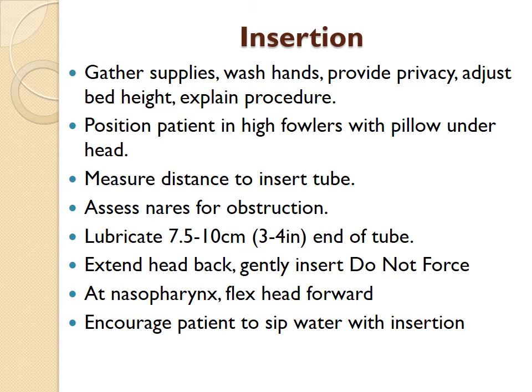Don't forget, if you have the patient down in the lowest position, you're going to be bending down to reach the patient, and the only person that's going to have a problem is you with a sore back. So you want to elevate the bed itself to be comfortable for you. You can be explaining the procedure while you are doing this. Then you're going to put the head of the bed up. Position them in high Fowler's with the pillow under their head. We're going to talk about it when we get into the lab. Because we're using mannequins, it's easier when we're doing the mannequins to remove the pillow.